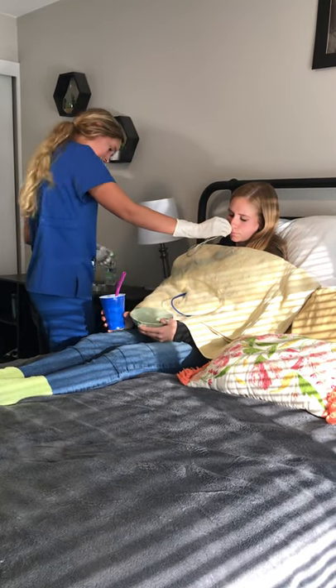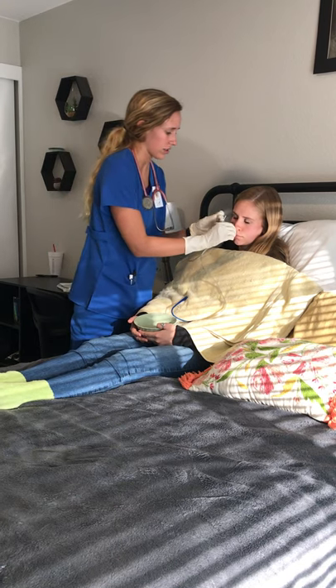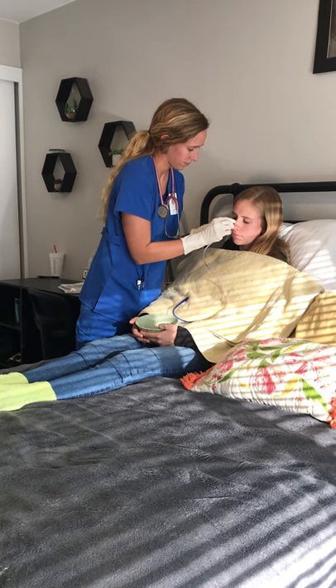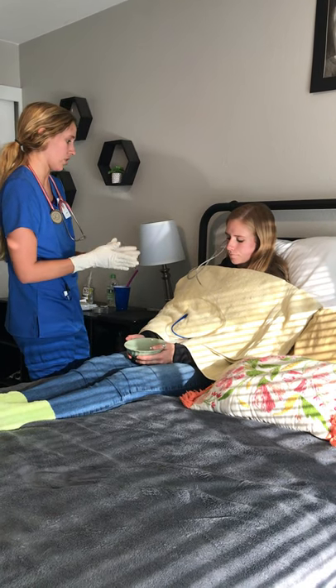Now I'm going to secure the device by taping it to her nose. Normally I would tape it to the bridge of her nose, but it doesn't want to stick there, so I'm going to tape it to the side. The patient had minimal gagging, no trouble breathing while it was being put in, and no coughing.